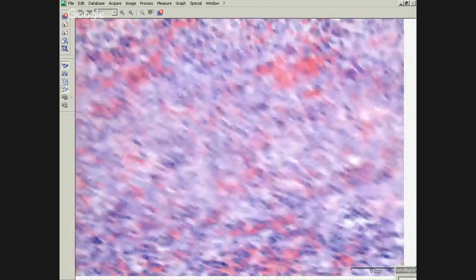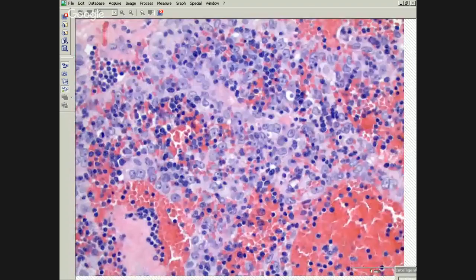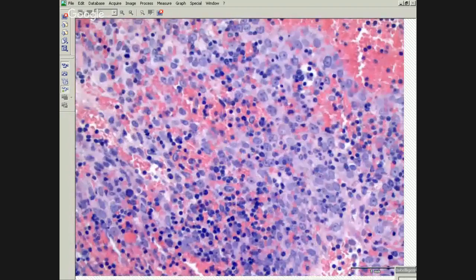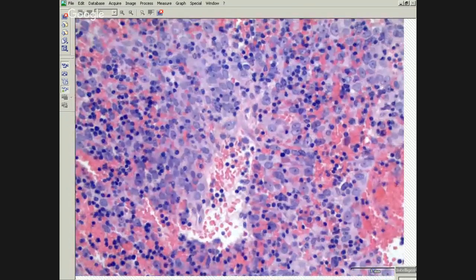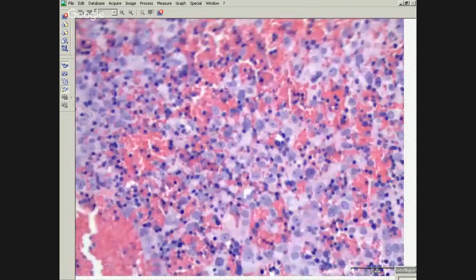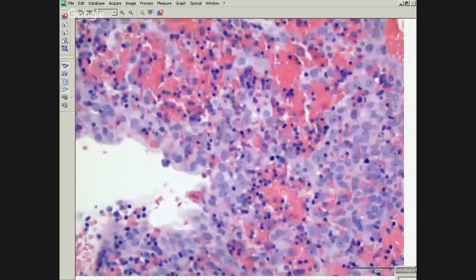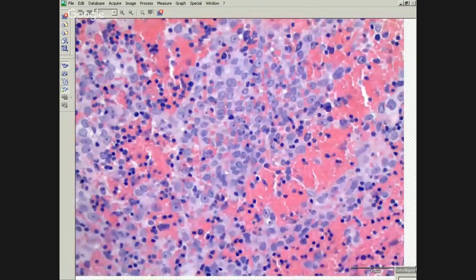So your differential's pretty broad here, given that our clinician neglected to tell us a key important bit of information. Is it a myeloid sarcoma or something? No, I wouldn't trick you guys that badly, but always a good thought, because anytime something isn't adding up, myeloid sarcoma is always a good thing to think of.